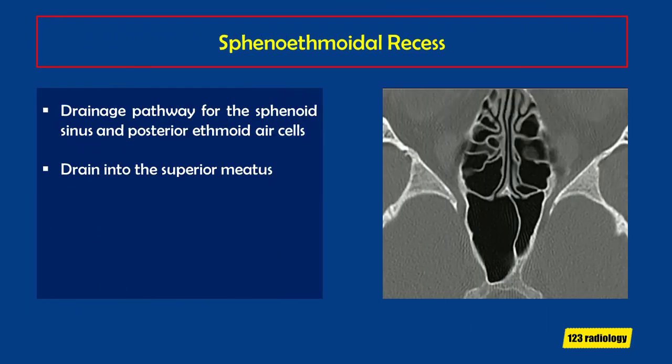The sphenoethmoidal recess is the drainage pathway for the posterior sinuses — the sphenoid sinus and posterior ethmoid air cells. This sphenoethmoidal recess drains into the superior meatus. As seen on this axial image, the sphenoid ostium drains into the sphenoethmoidal recess, and the posterior ethmoid air cells join this recess as well, which then drains into the superior meatus.